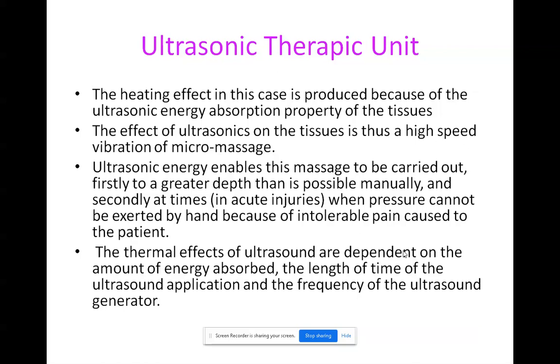So to overcome that disadvantage, you are going to use the ultrasonic energy, which will make the massage be applied without any pain to the patient at the time of injuries. This is the advantage of using ultrasonic energy rather than manually doing massage.